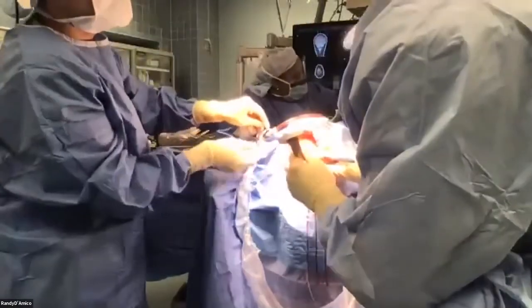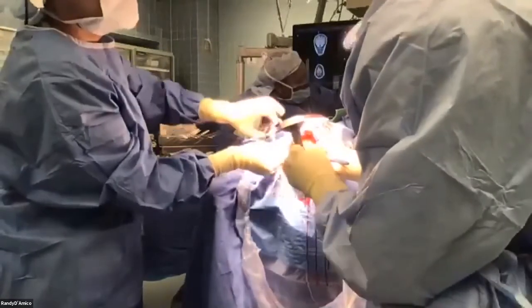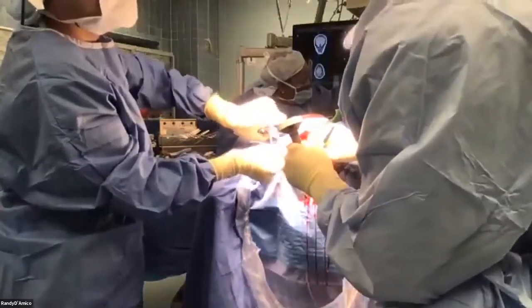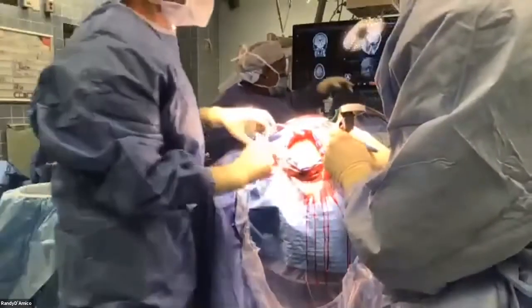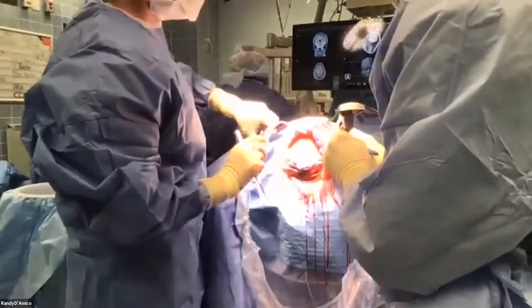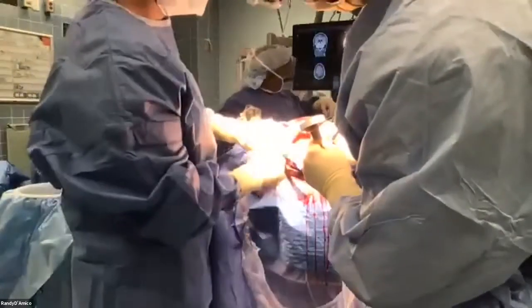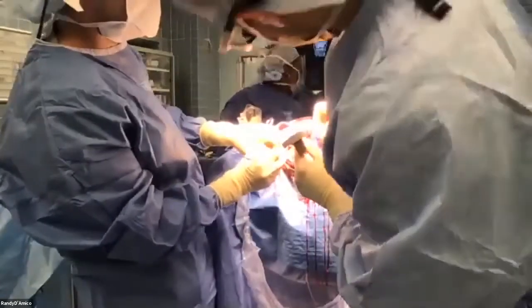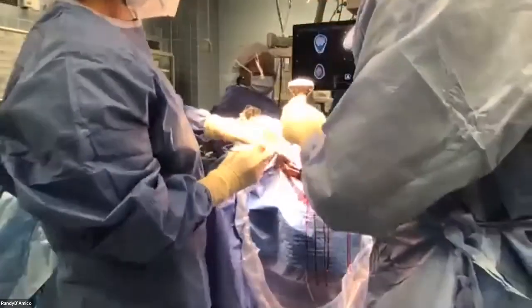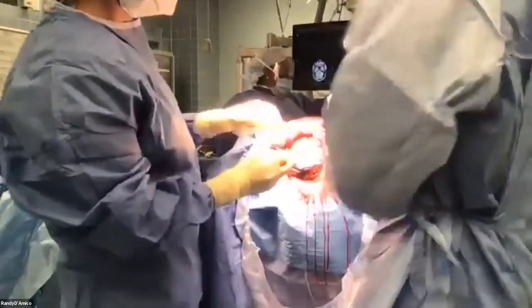I want to see the back of this thing, which is going to be far back. It's going to be basically here. Like this is probably good. All right. So let's open the skin a little bit. This is midline, is it? That's midline. That's going to be the front. The back's going to be further back. A few burr holes over here. So I don't think we need to cross the sagittal.